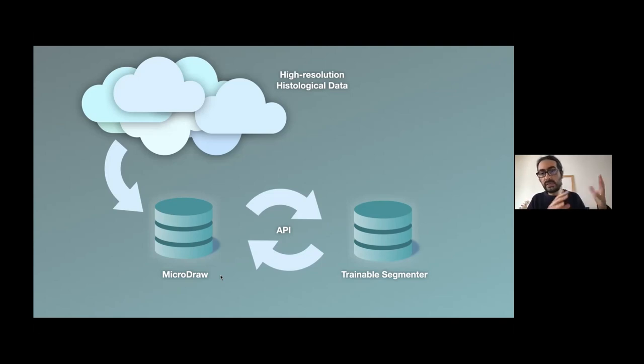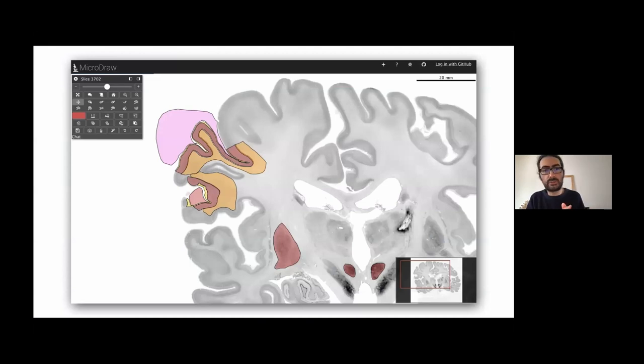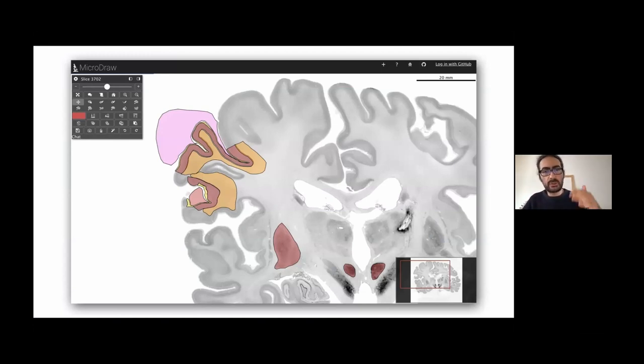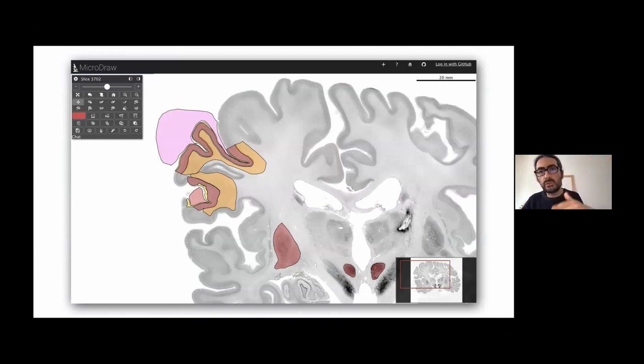So the idea with a trainable segmenter is this. This is our implementation that's currently working. So we took, for example, one slice of the BigBrain. This is slice 3700, which is kind of in the middle of the stack, in coronal slices. You just segment some regions and you say, this is region one, this is region two, any regions.